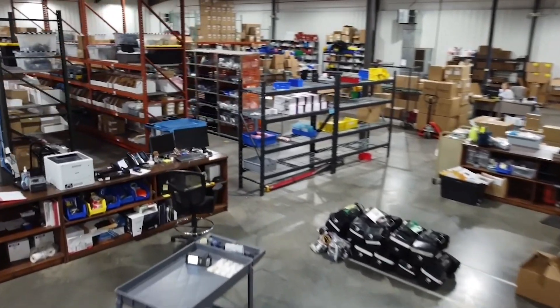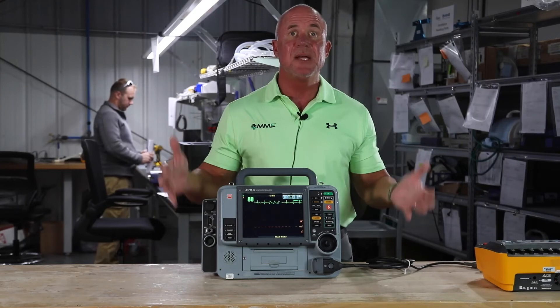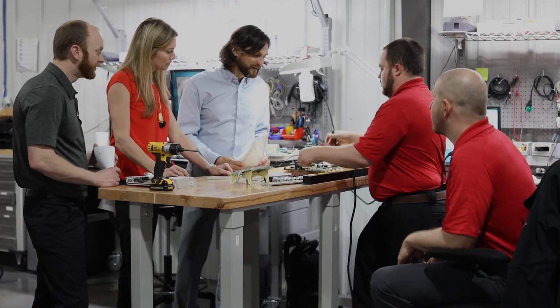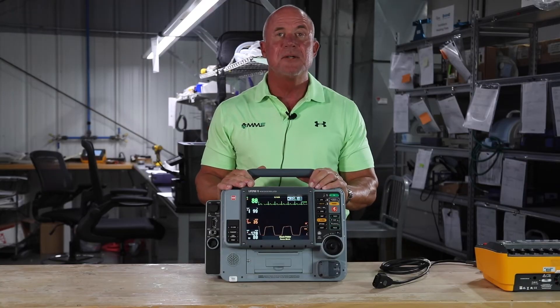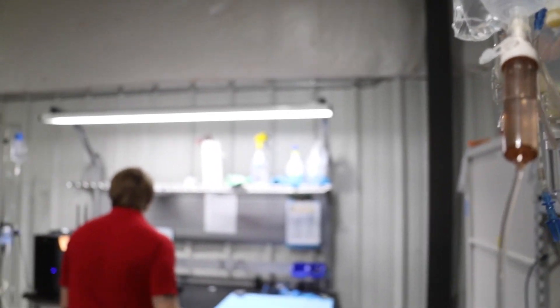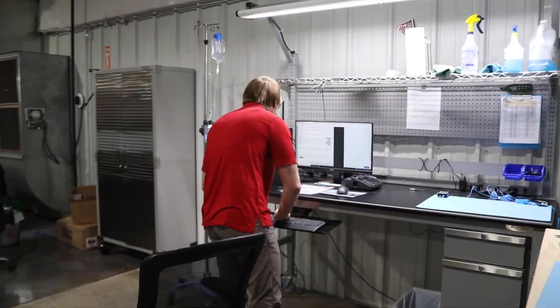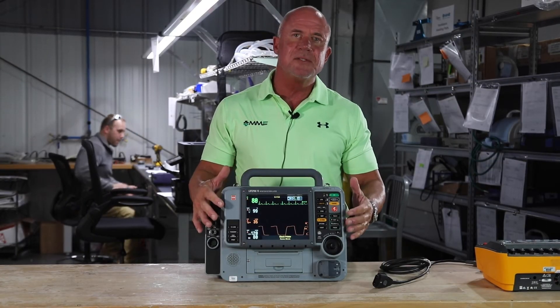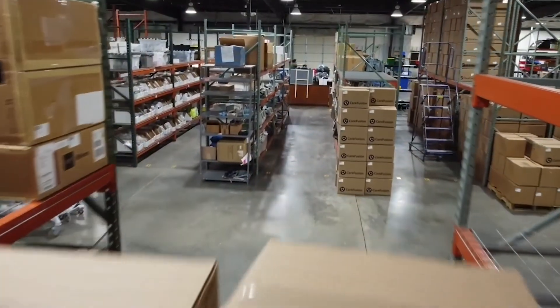When you purchase a LifePak 15 from Master Medical Equipment, we're going to ship you everything that you need so that it's patient ready, and we're going to include a one-year warranty backed by Renew Biomedical. We have factory-trained certified biomedical technicians to take care of all your needs. We even have an onsite service option now and could be in your area very soon. All our devices come patient ready — that means we include all the accessories to make your device usable the second it arrives at your facility.